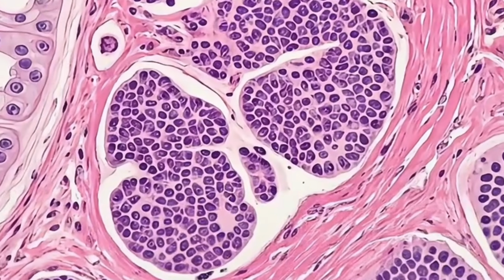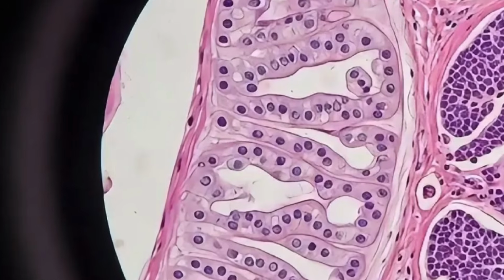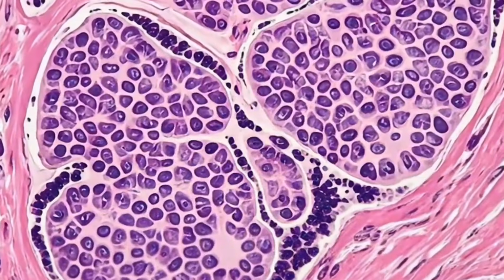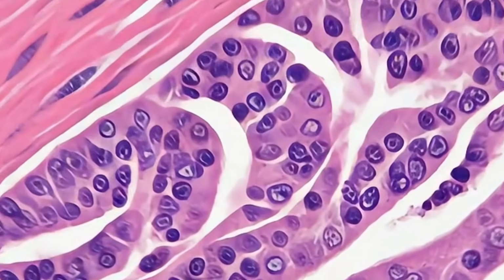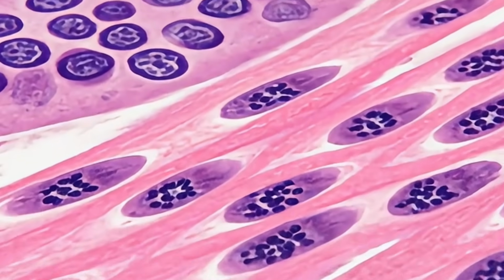This is the first clue. A normal duct stays within its own boundaries. These abnormal glands do not. They have broken through the wall of the duct and are now growing into the surrounding breast tissue. That single microscopic finding changes everything. This is exactly why the pathologist uses the word invasive.